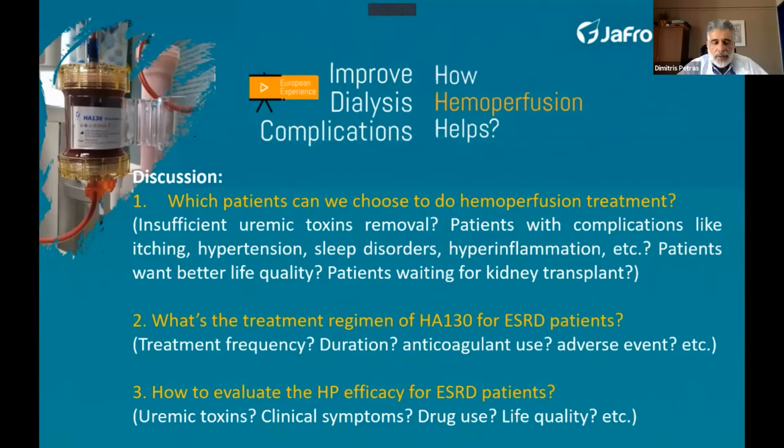Okay, so in our patients, now we have 15 patients. We start with once per week for 1 month, then once every month. Now all the patients have about 6 months, and we haven't stopped.